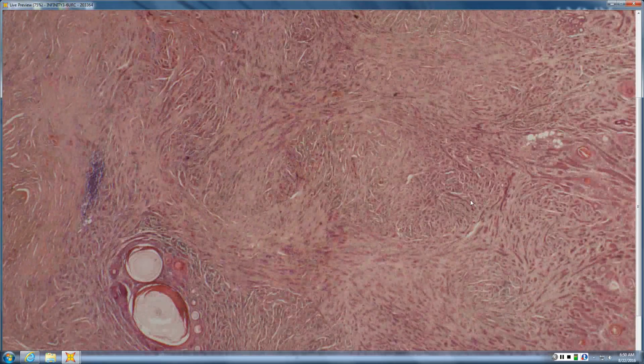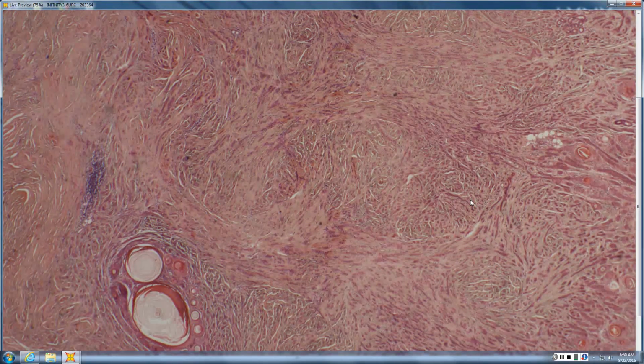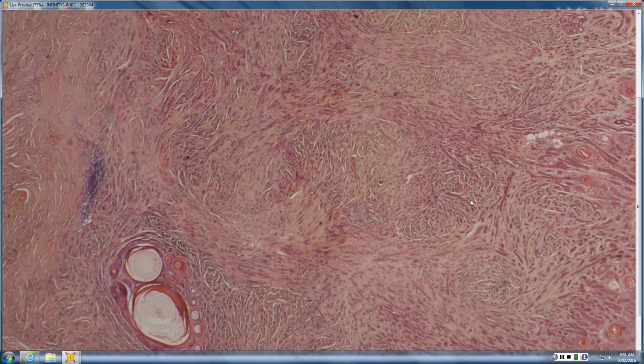So remember the Paisley-Tie differential: my suit defines my body. The M is for MAC. The suit stands for syringoma. Defines is desmoplastic trichoepithelioma, and then my body is morphoeic basal cell. And so all those things can look very, very similar, and there are just some subtle clues sometimes to help point you in one direction or the other. Sometimes it's still a differential. In fact, one of the answers on this list is Paisley-Tie differential, and it's not actually a diagnosis. But there are some things that can point you in the right direction.